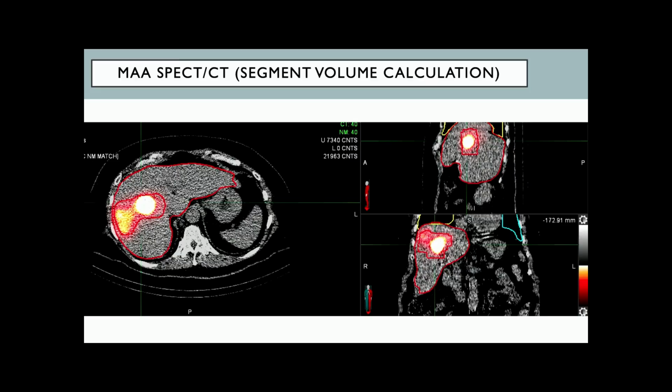Even though this would fit a UNOS T1 or T2, this is not a case I would go as a same day map and a single session treatment. The peripheral ones, though, you can start. We just published our data, and it actually has economical benefit as well, and it significantly shortens the time to treatment when you go with the single session. Hopefully we can talk about that more.